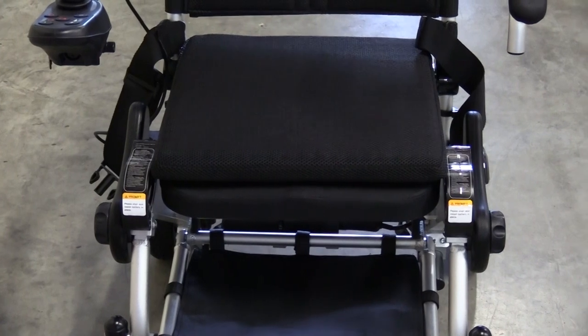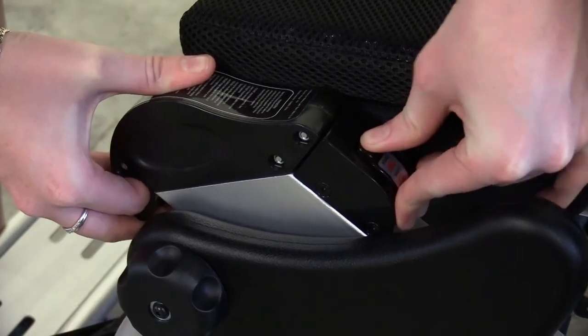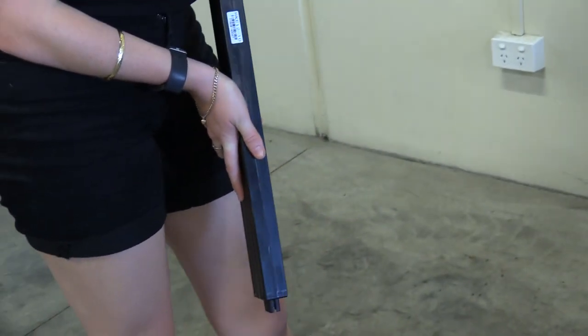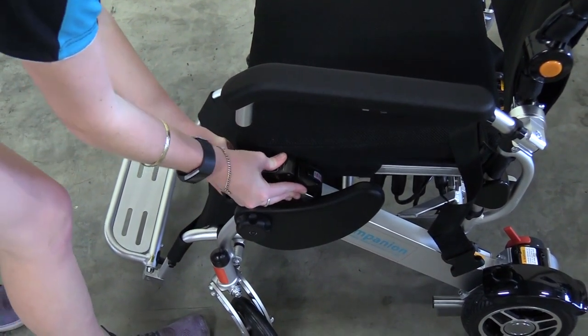In the event of travel, you may need to remove the batteries. They are located on either side of the seat. To release the battery, press the button while holding the battery grip and pull the battery from the holder. To remount the battery, line the battery bottom with the battery holder and slide it in. The battery is securely mounted when you hear a click.